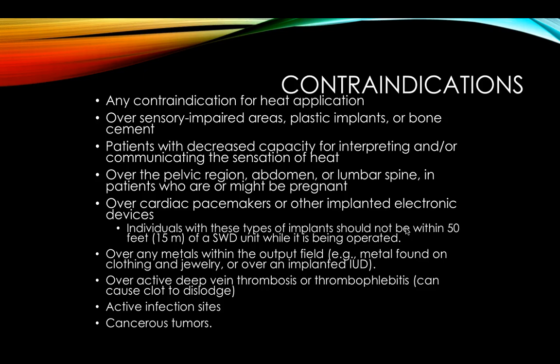Over sensory impaired areas, has been the same for most of our heating modalities. Over any plastic implants or bone cement, that was similar to our ultrasound as well, those areas heat more significantly than the normal tissue, so we'd have concerns there. A patient who can't tell us and express the amount of heat that they experience, that's going to be a problem because we're going to use that to help judge our settings.